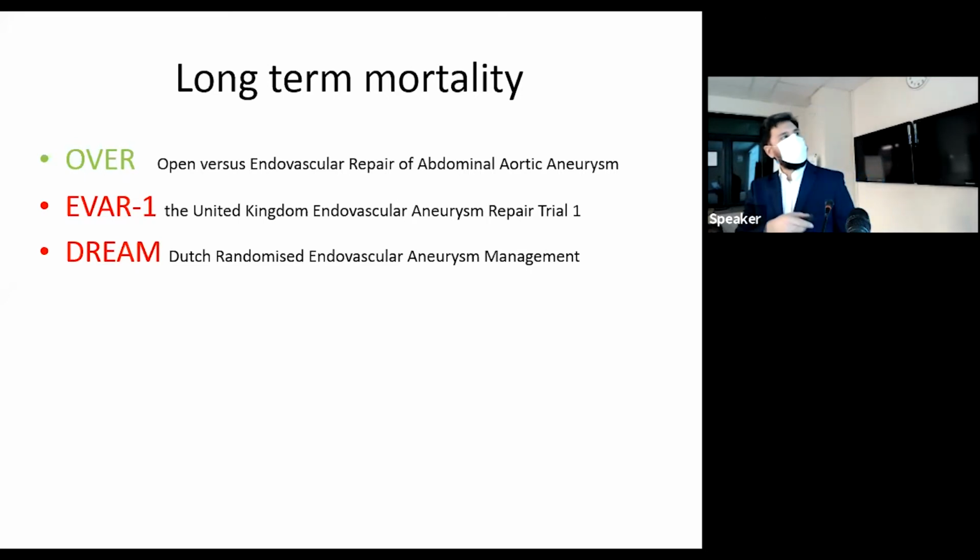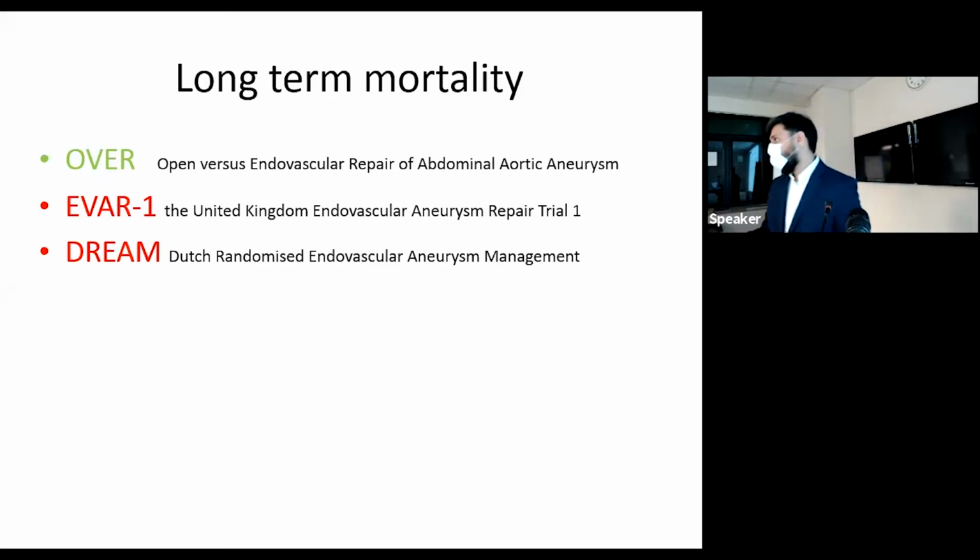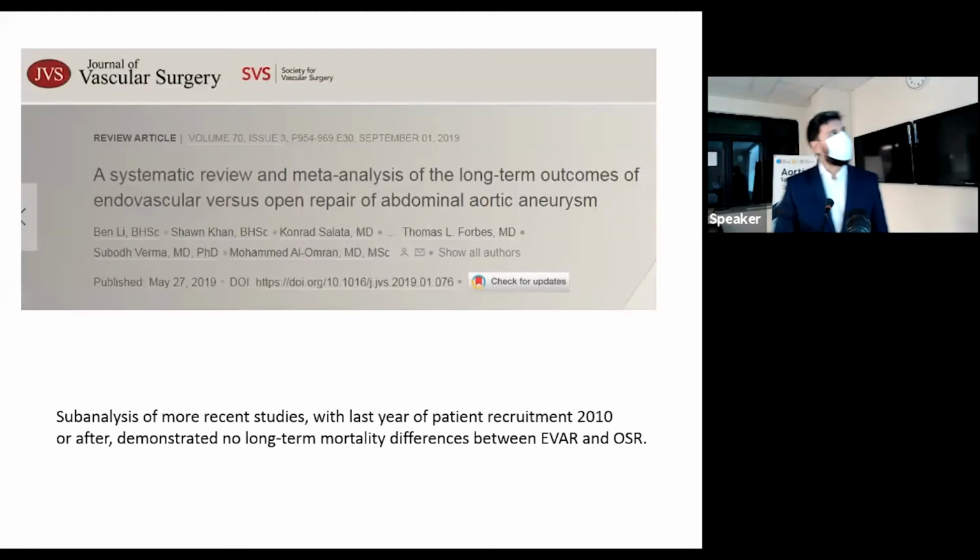And in EVAR1 and DREAM, the recent reanalysis has shown that perhaps the lines converge, and maybe that there's lower survival long-term in EVAR patients. However, the OVER trial, which I think was quite recent in 2019, did this update looking at the long-term survival in the US, and they don't see any difference in long-term survival. So the jury's still out on that.